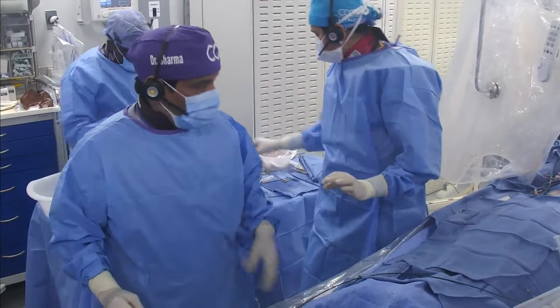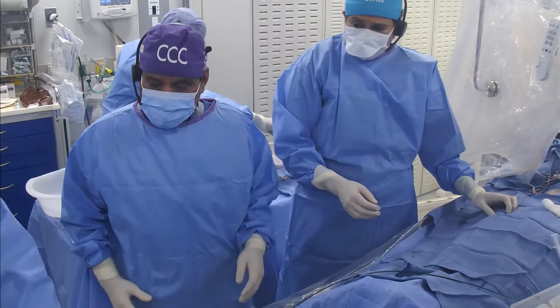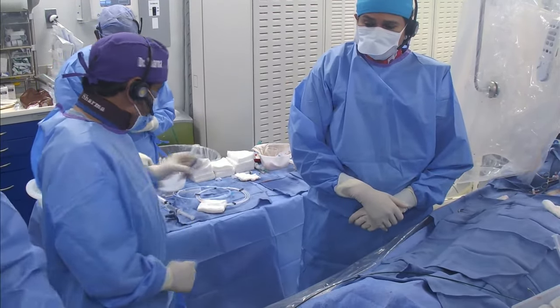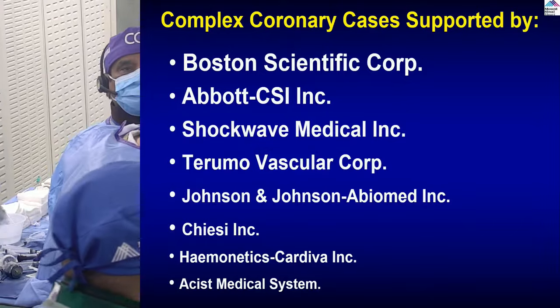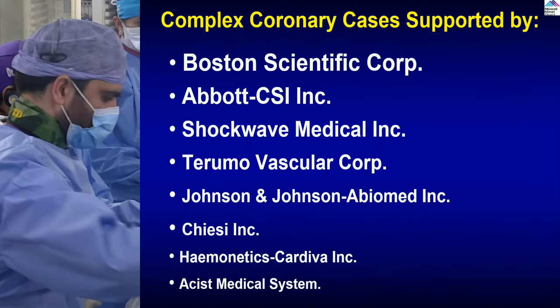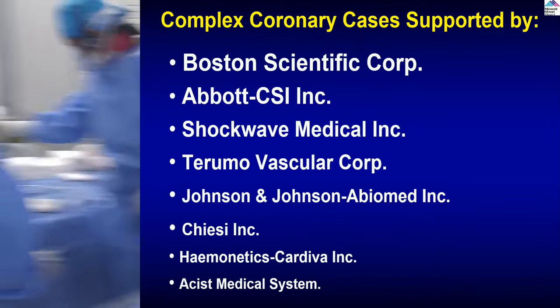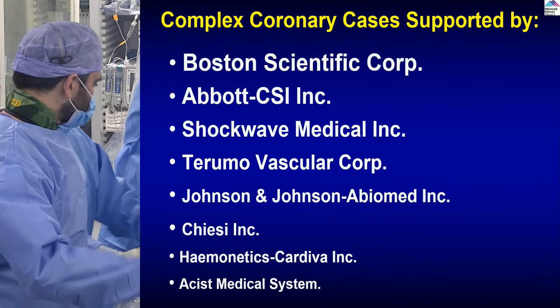Yeah. We'll use a longer sheath, because I actually have the pictures from the last time in terms of complexity while we are getting ready with the sheath. Let's show our slides meanwhile. Along with the long sheath, are you also using a 7 French guide? That is correct. Because of the bifurcation case with a mini crush, as we announced, we're going to use a 2 stent technique, and that's why it's 7 French.